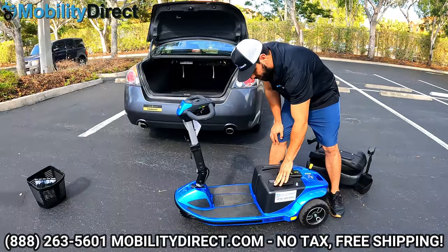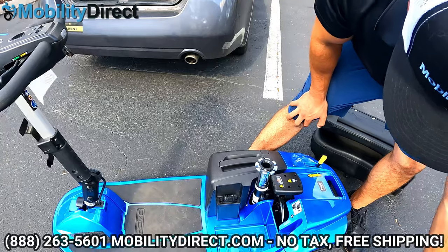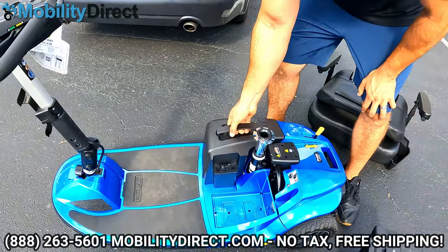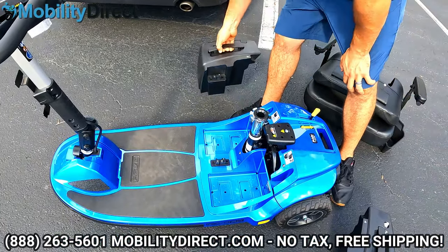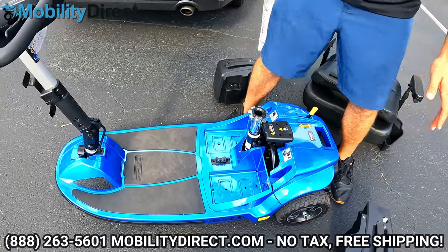There are two battery packs and each has a handle. You want to grab the left one first and pick straight up, then grab the right one and pick straight up as well. They're not very heavy, and at this point the unit is almost fully disassembled.